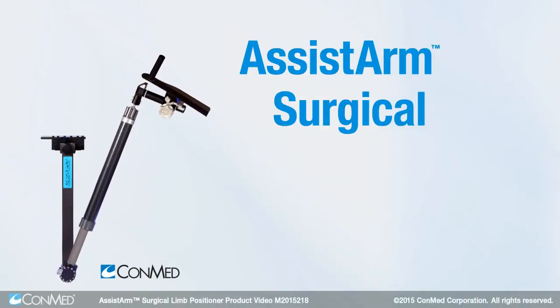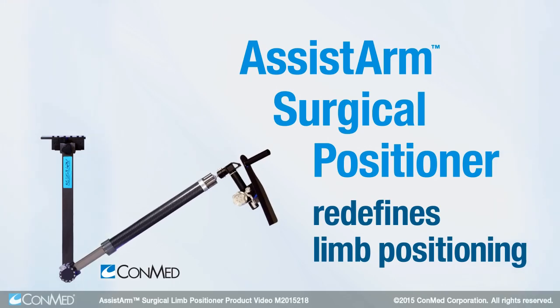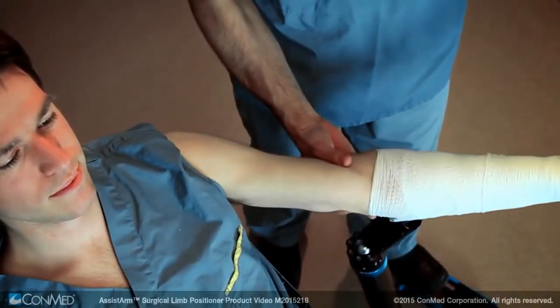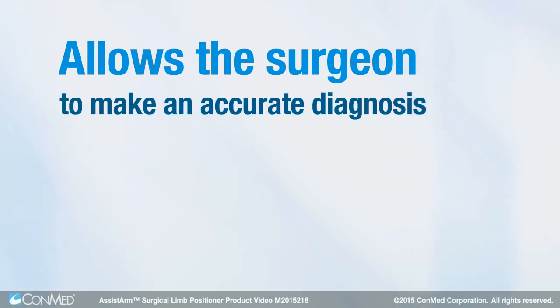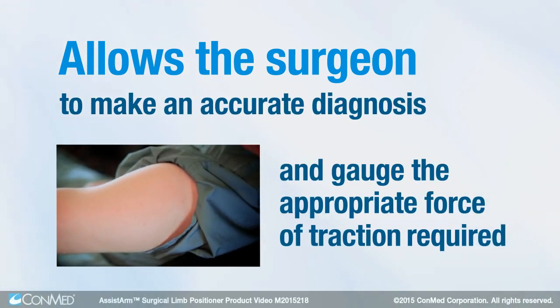The new Assist Arm Surgical Positioner from ConMed redefines limb positioning during arthroscopic and open-shoulder procedures. Innovative materials and advanced design enhance the manipulative sensitivity of the Assist Arm, which allows the surgeon to make an accurate diagnosis and gauge the appropriate force of traction required on the limb.